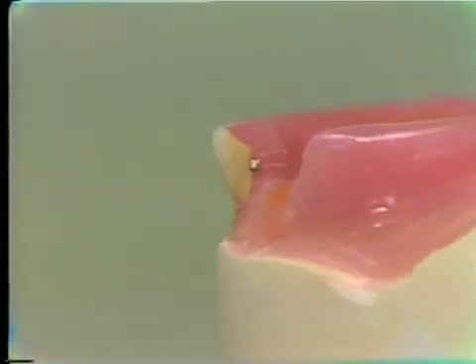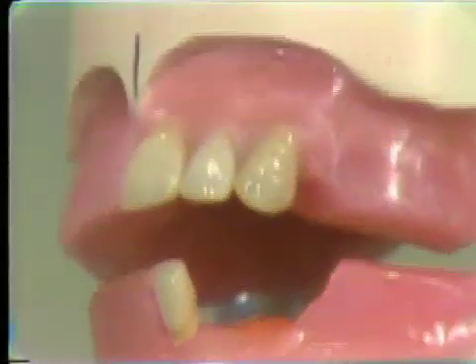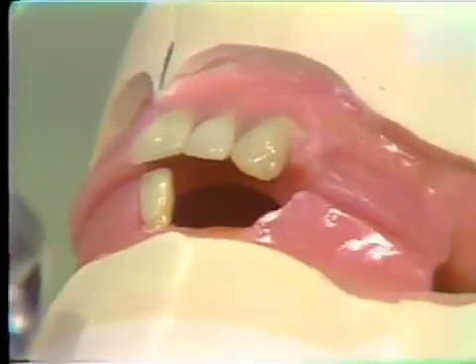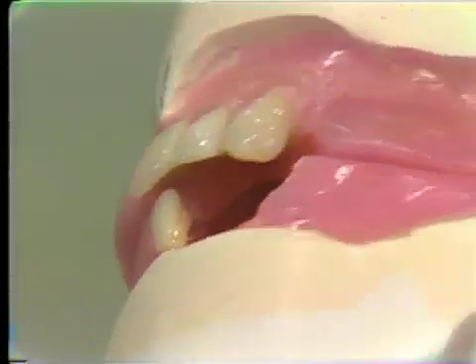And then it has a labial tilt. You can see that as I rotate the articulator. Then when the articulator is closed into place, we have our millimeter, or possibly a little more depending on the case, of horizontal overlap or overjet. You can see that very clearly in this picture.